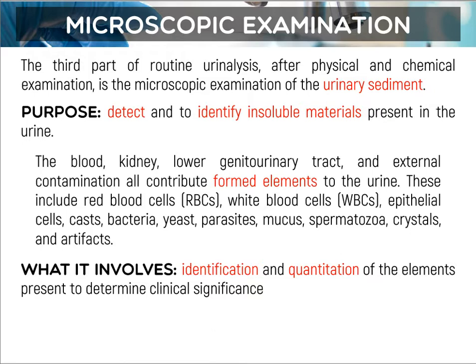Because some of these formed elements, guys, are of no clinical significance siya. So, they are consequently considered as normal unless they are present in increased amount. Therefore, the need for the quantitation.